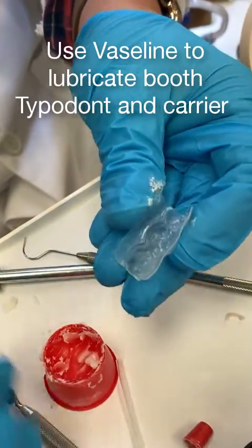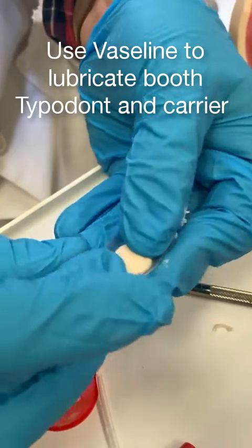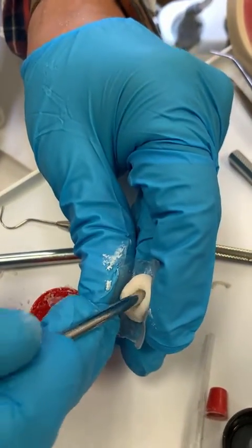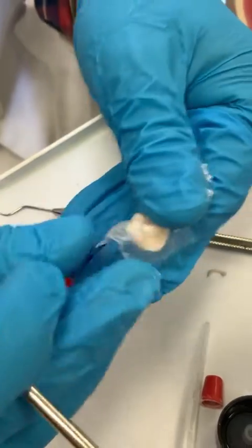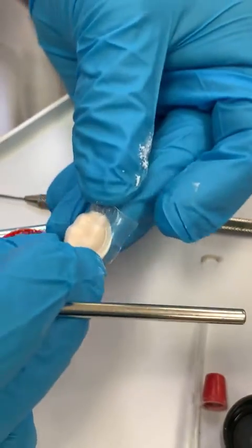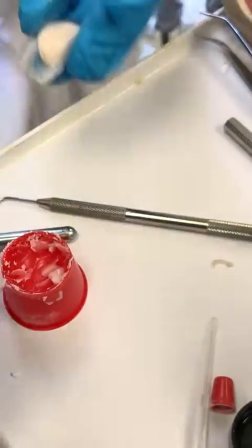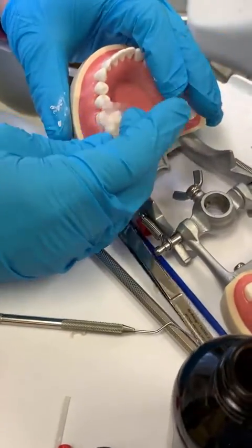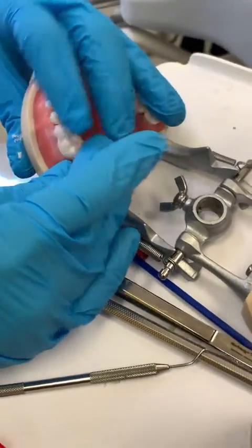I'm going to put this in here and press it down. I'm going to use the back part and press down — it's clear so you can see if there's any bubbles, and we can press it down. The next thing you want to do is make sure it looks real good.